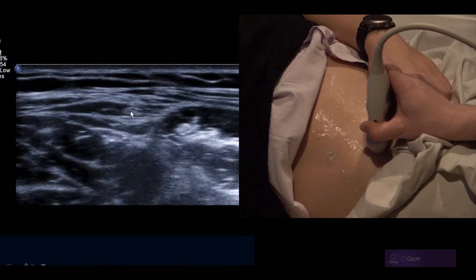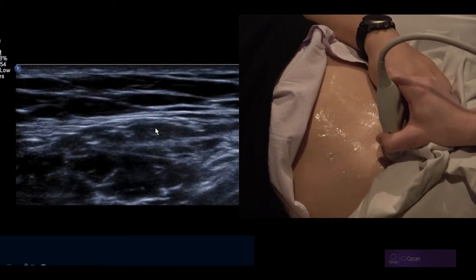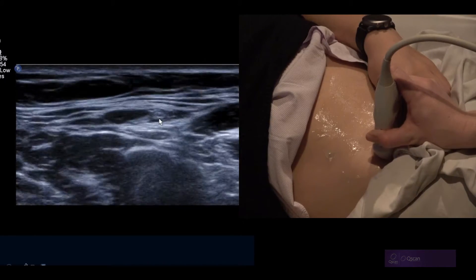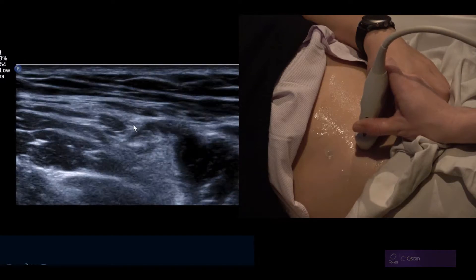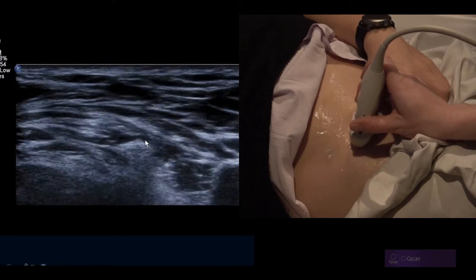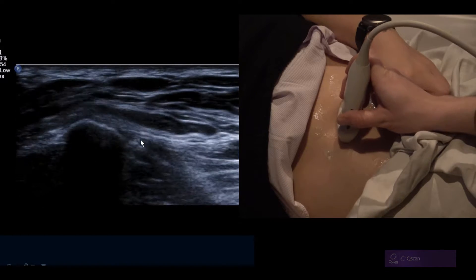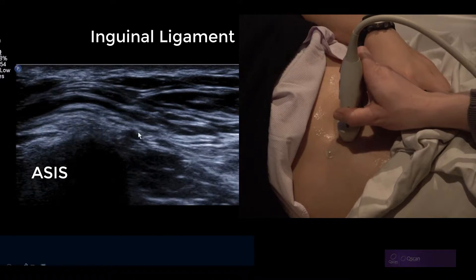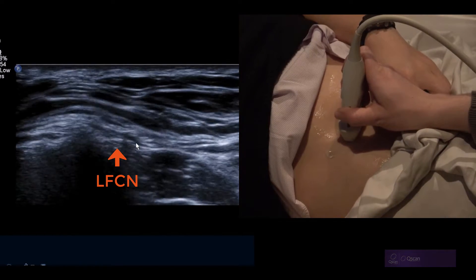So it can be a cause for anterolateral thigh pain. If it's too difficult to find in transverse, we can try a longitudinal plane. You can just see the nerve split into two little branches there, which is quite common. The hot spot where we want to see it is back up at the ASIS, as it passes through or underneath the inguinal ligament — variants exist. This is usually the site of compression, particularly in a larger build patient.